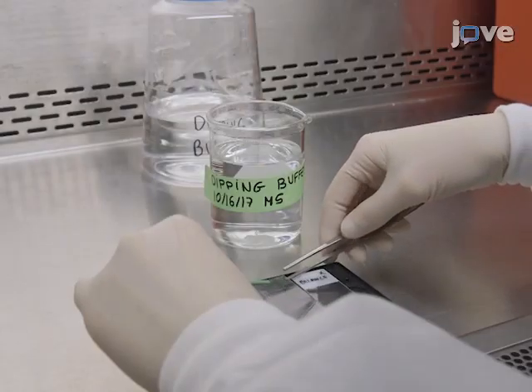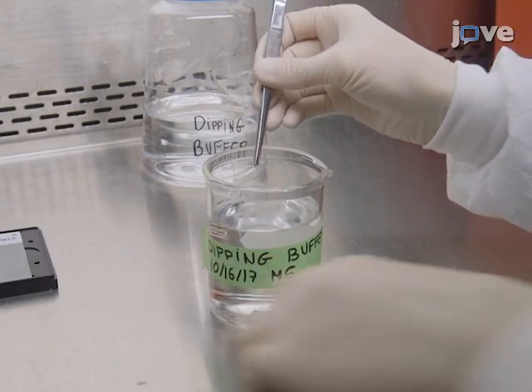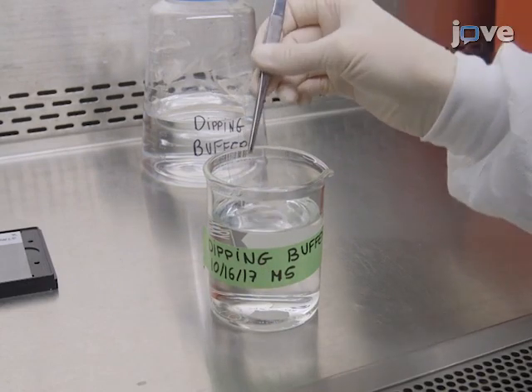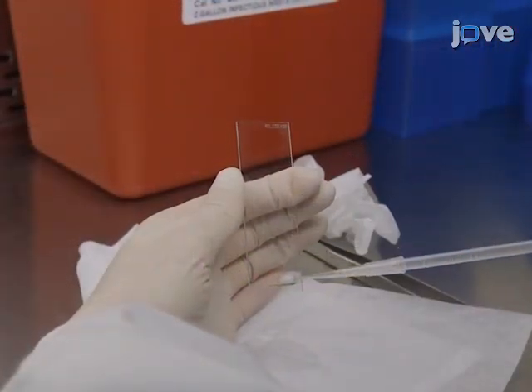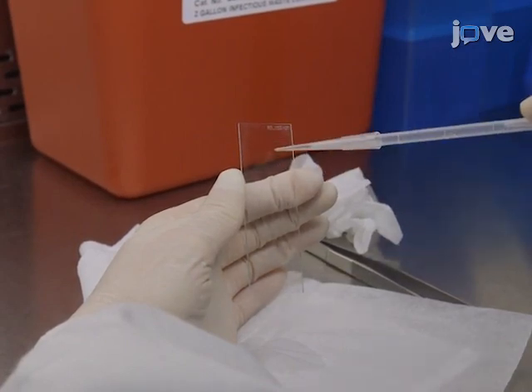To perform microarray scanning, immerse the slide twice into 200 milliliters of freshly prepared dipping buffer. Dry the microarray for around 1 minute by very carefully aspirating from the top to the bottom of the slide without touching the slide surface.